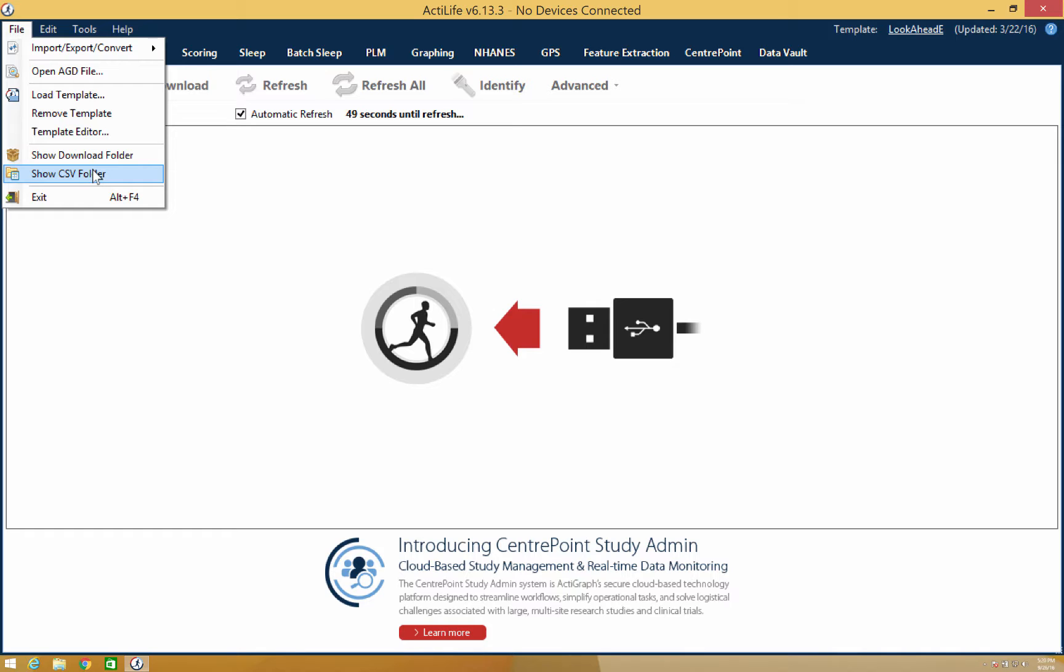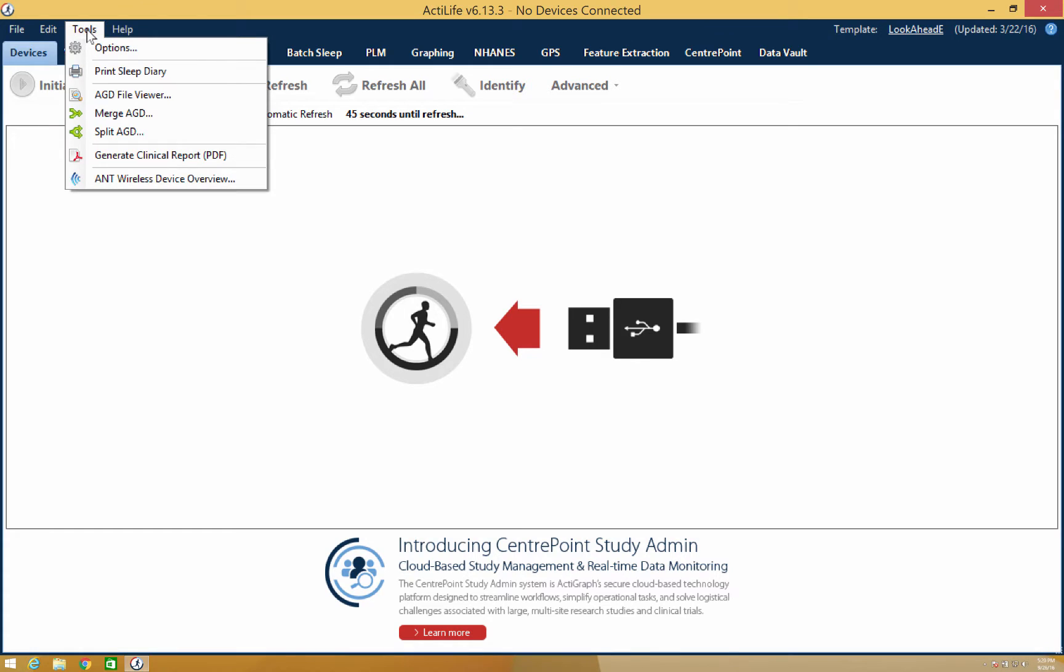The next option that we will cover is the Tools tab. Under Tools, we'll first look at the options.